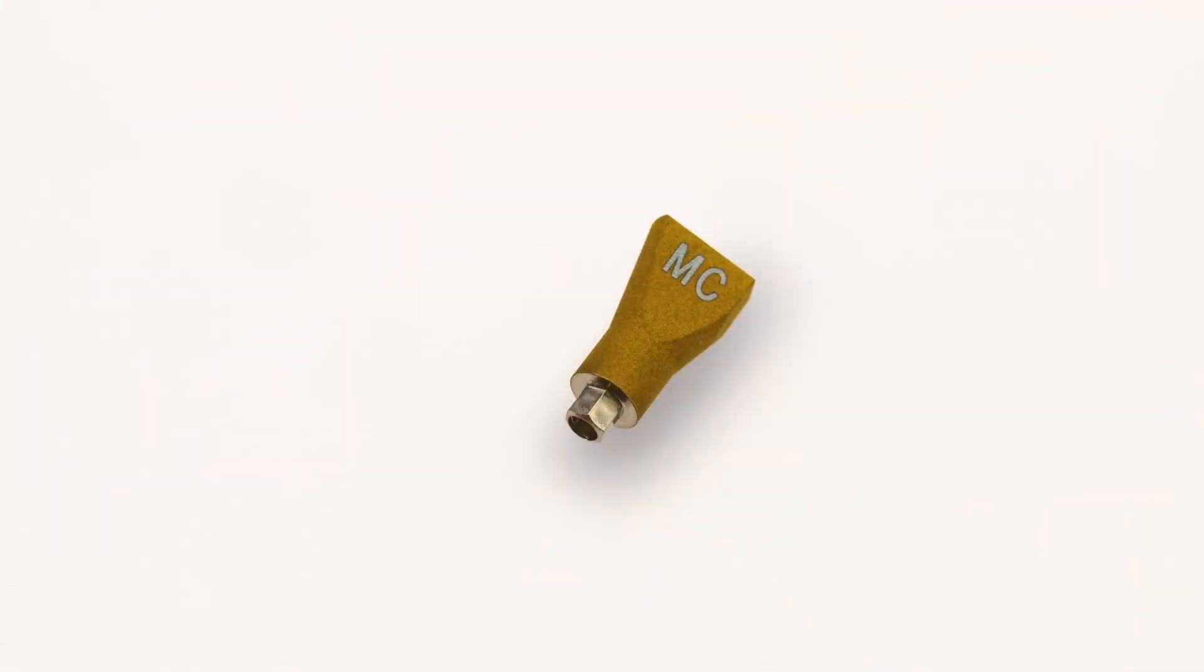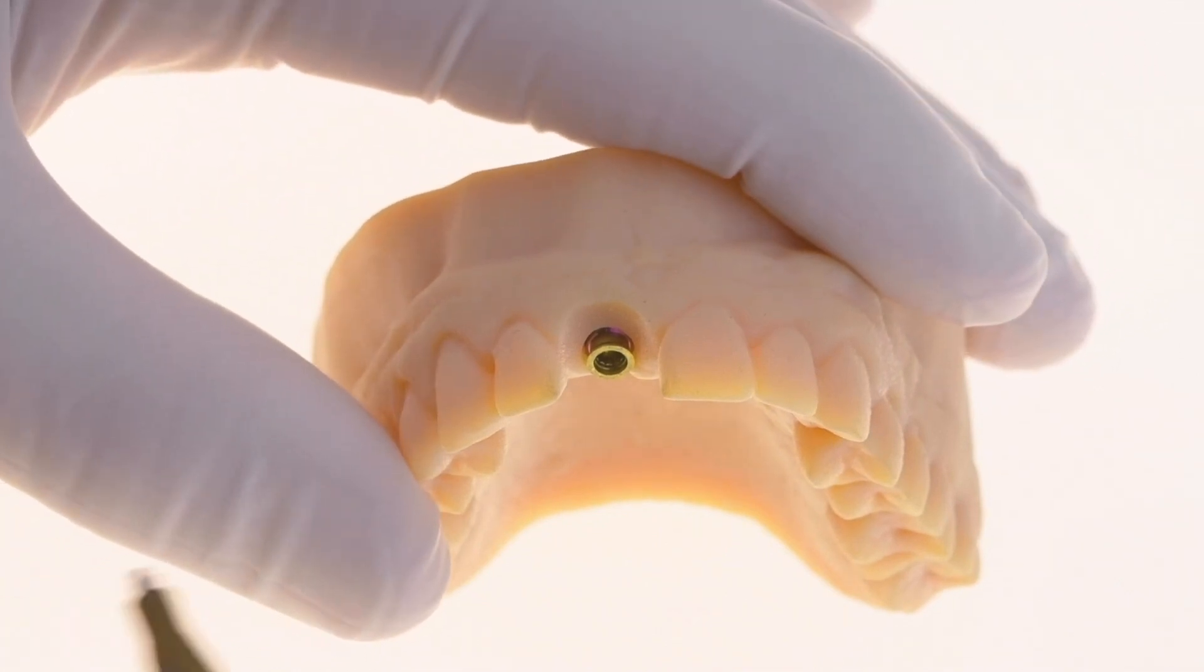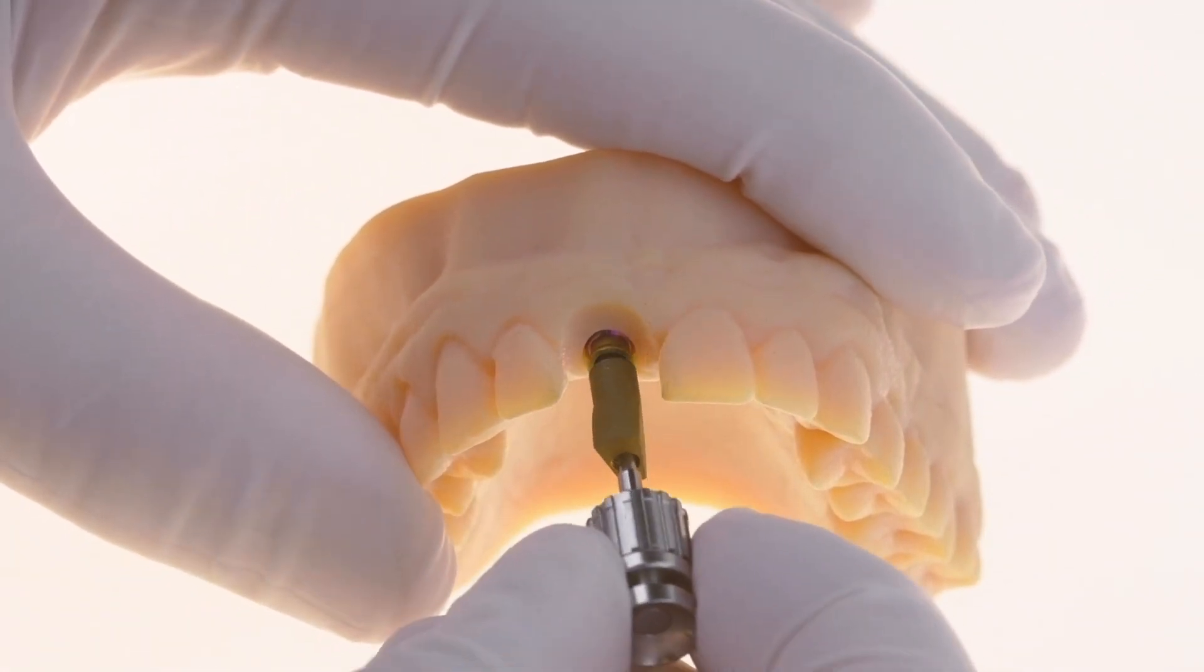We use a scan post which is attached to the Connect, positioning it with the flat, narrow side oriented towards the lingual or palatal.